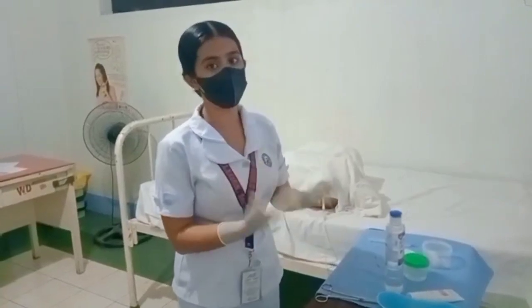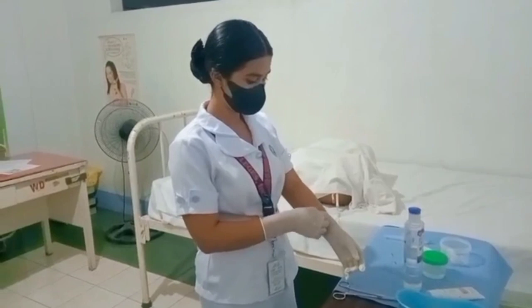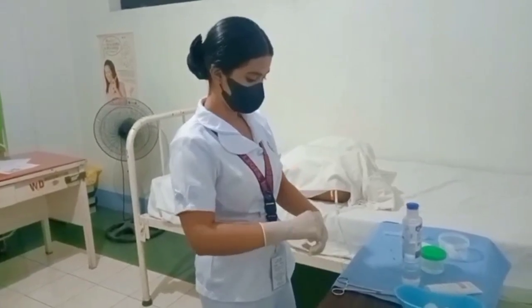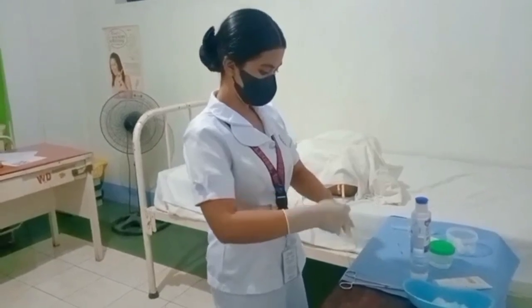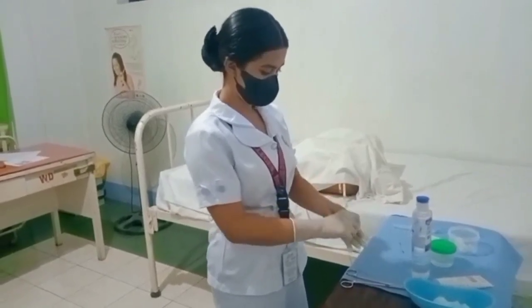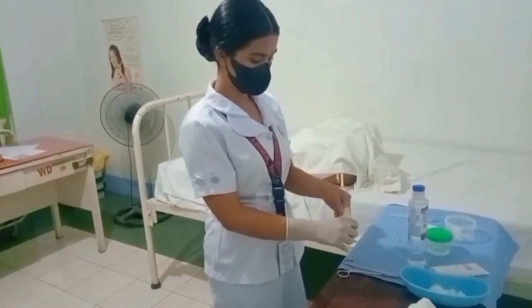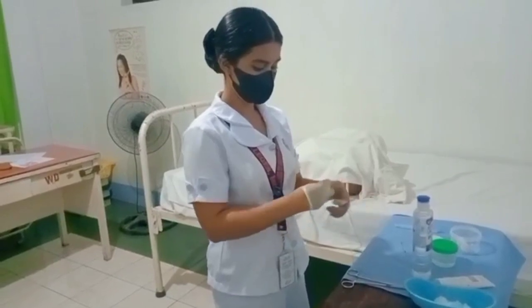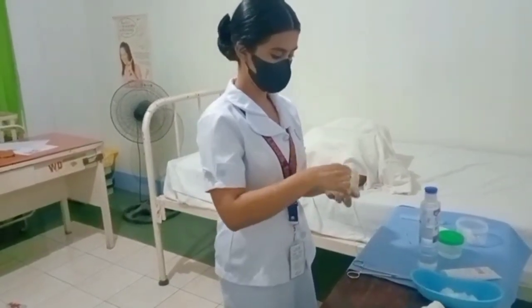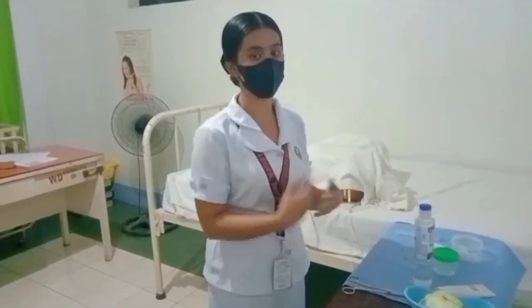Gather and discard the disposable equipment. And then I will wash my hands.